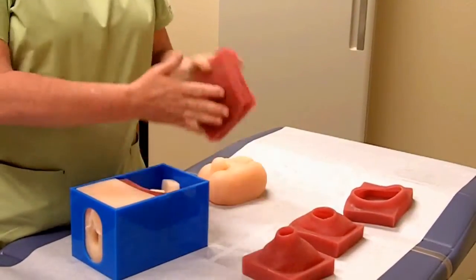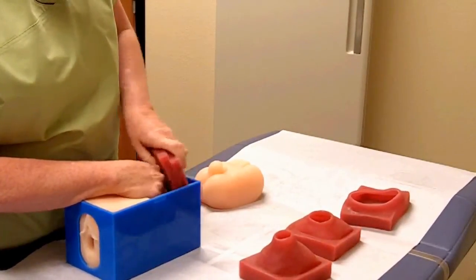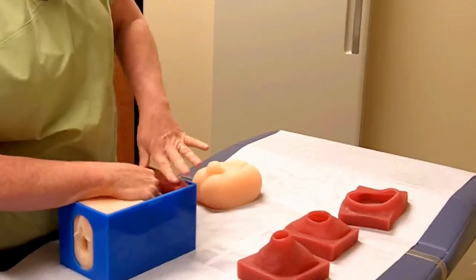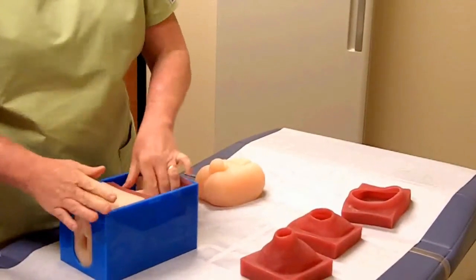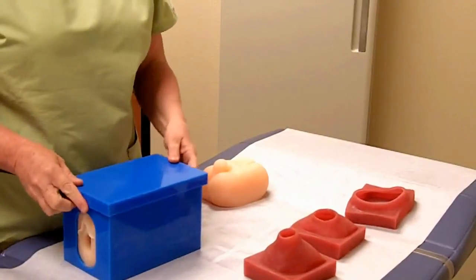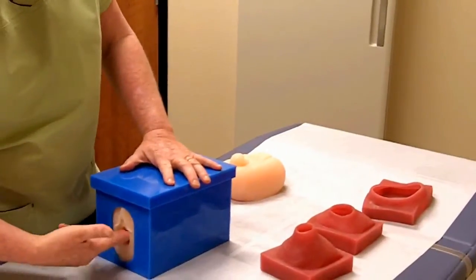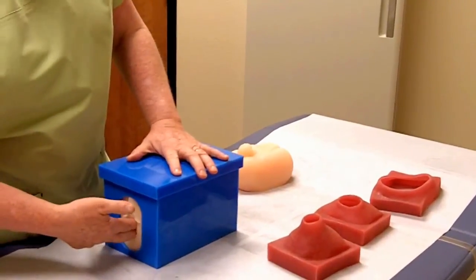I'm going to use the fetal head and I'm going to place it just behind the cervix. These are spacers that you can use in order to press the presenting part up against the model. You then cover it, and the student begins her evaluation.